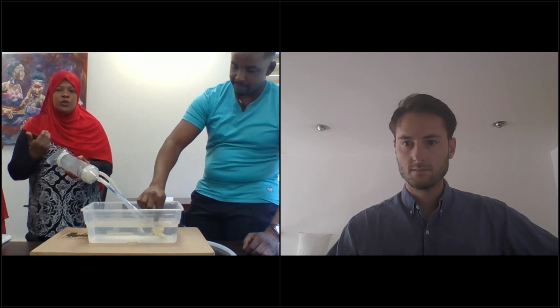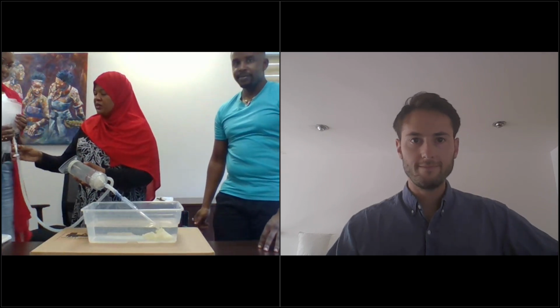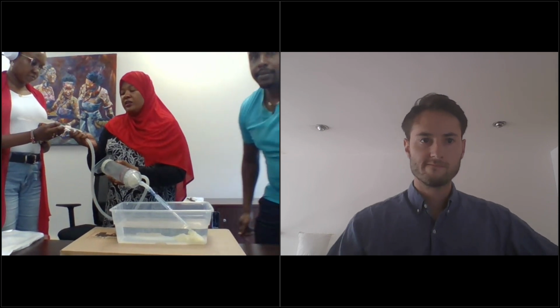I will navigate the plunger, pulling in and pushing out, and I will have my colleague on this side navigating the blood bag. One of the most important things is understanding how you are operating the stopcock, where this off sign means this side is blocked. Another thing is ensuring that you're rocking the blood so the anticoagulant mixes with the blood that is there.